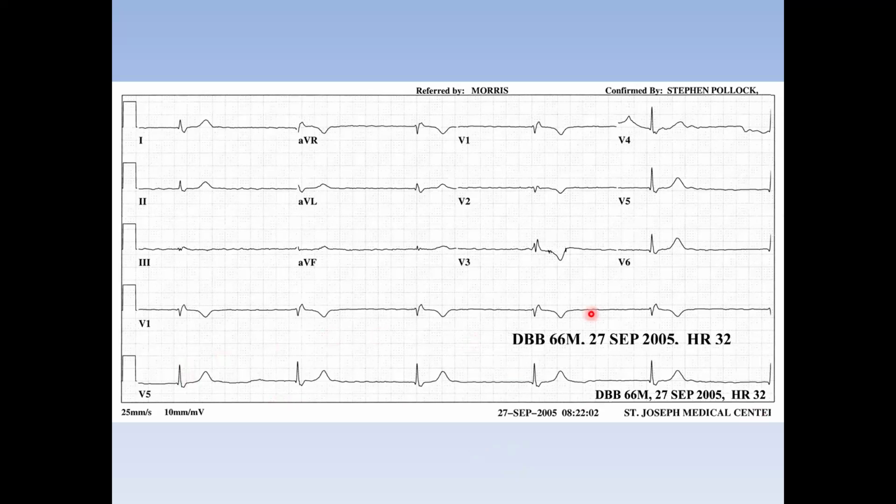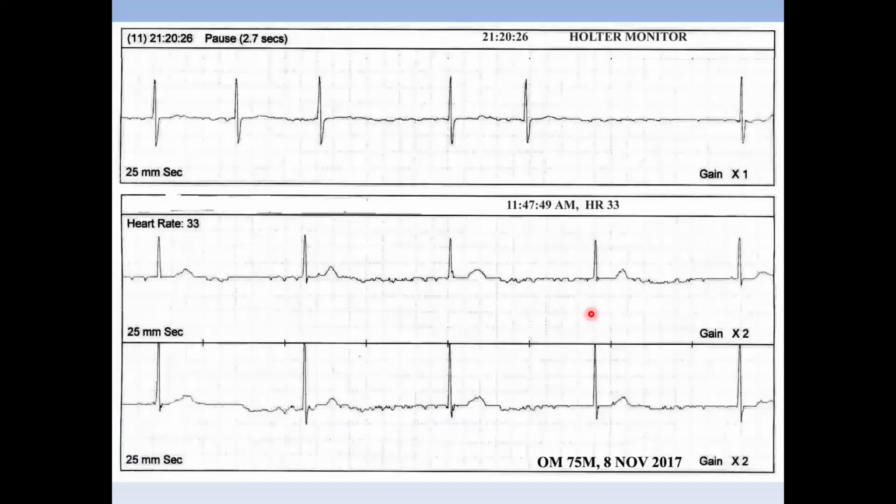So it's the regular QRS complex, but there is no preceding P. Sure. So the question is, I was always curious. We have been believing these things. How do we prove it? Because there is no way of proving or disproving it. But I have some ECGs.